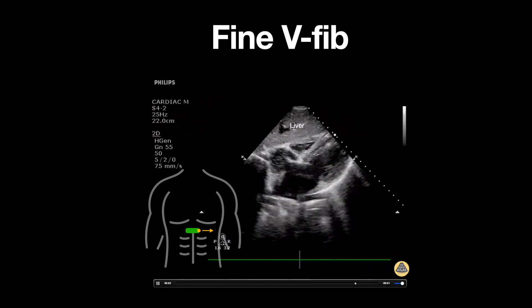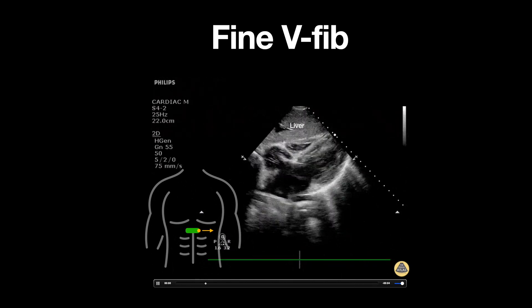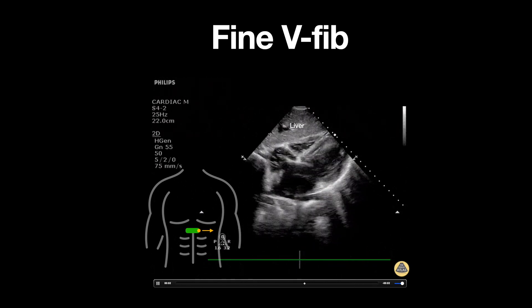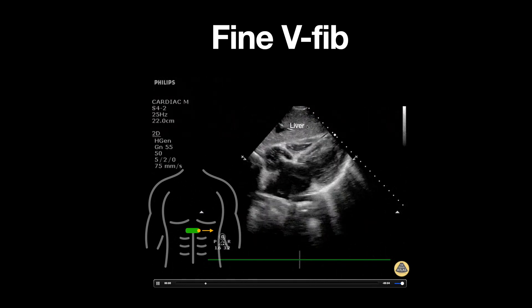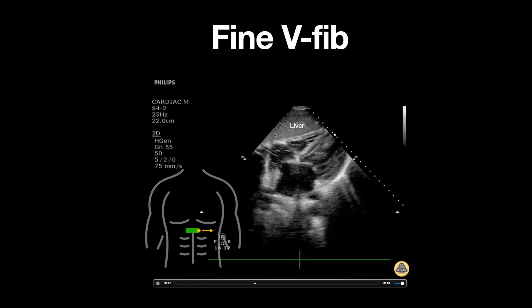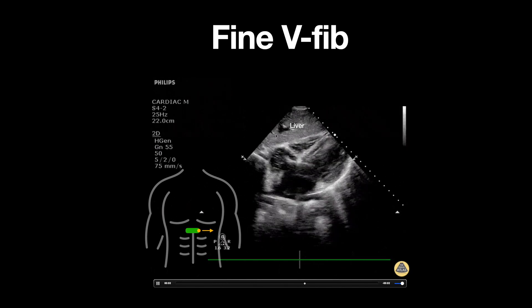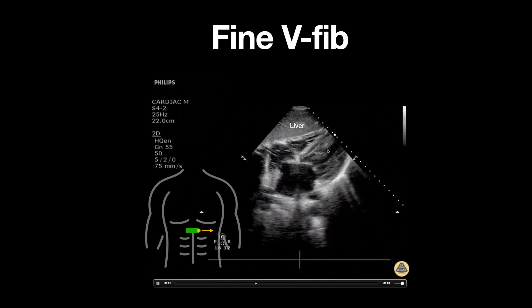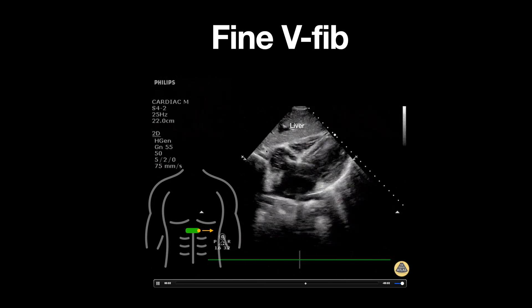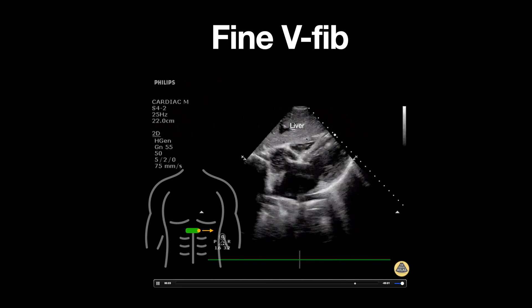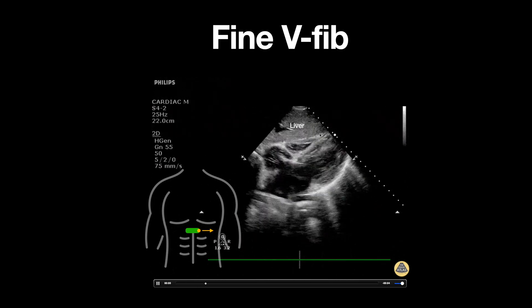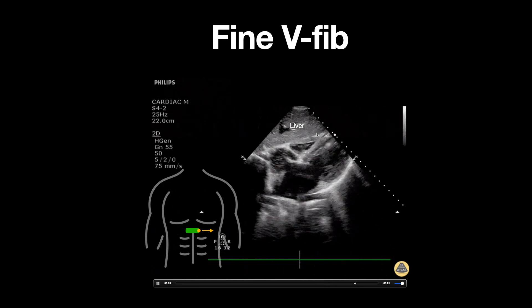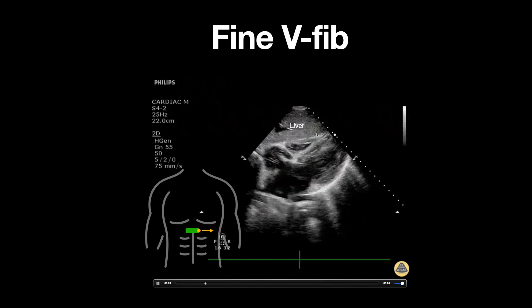In this view we can appreciate the liver at the top of the screen. This tells us that we're in the subcostal space, as this is the only cardiac view where the liver will be visualized. Just below this is the pericardial space, and we notice no anechoic fluid in this area, ruling out a pericardial effusion.